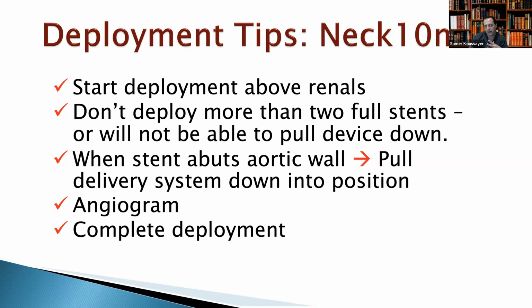So there's no need to do an angiogram before you start, unless you are looking for something else, if your pre-op planning is not right, or you want to question the lengths or whatever. But otherwise, if you have good planning, you don't need an angiogram before deployment. So what happens is you wait until you put the super stiff wire and the device. When the device is at the level of the renals, before you deploy, then you do an angiogram. And then you mark your renal, and then you start deployment. But don't do an angiogram before you put the stiff wire and device.